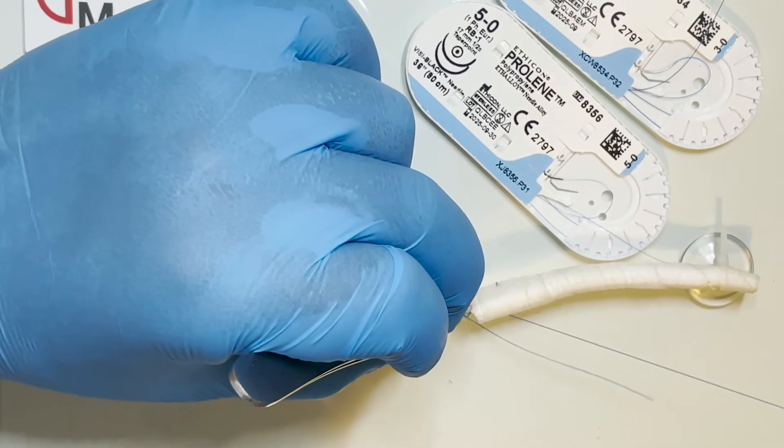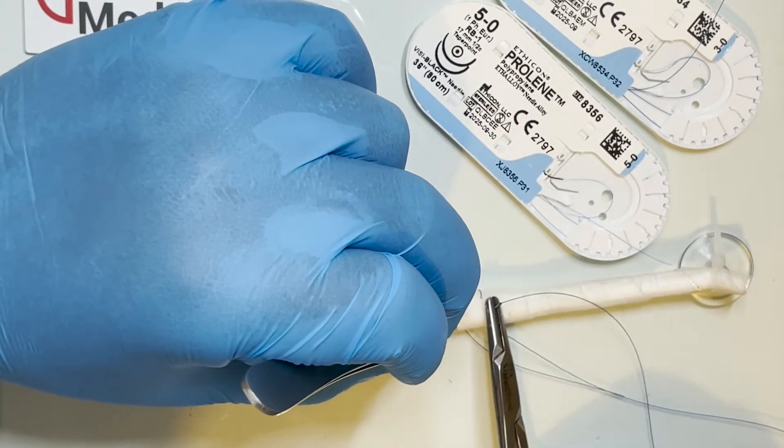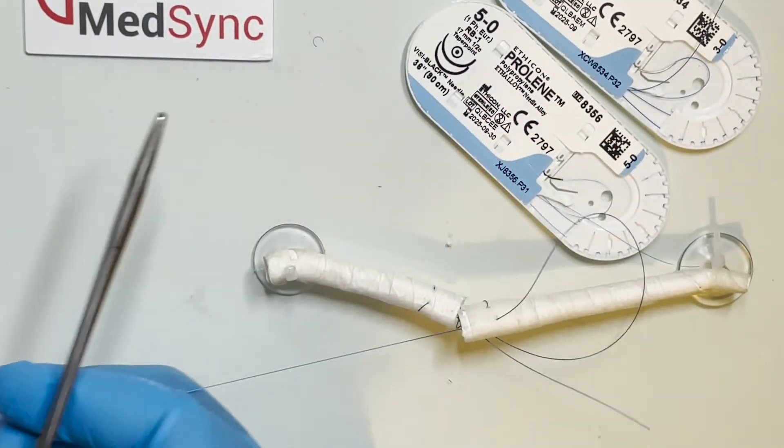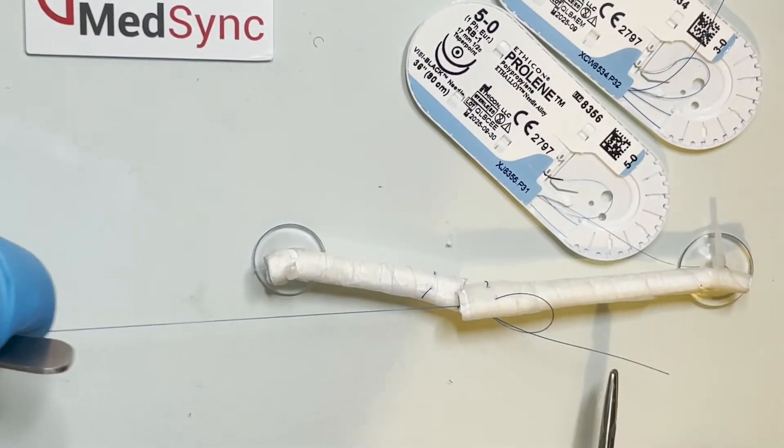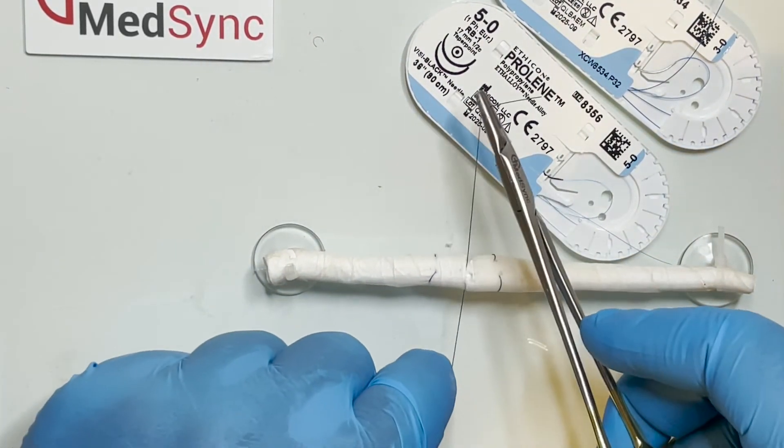A final pass is made axially back into the repair site and the suture ends tied. For a monofilament, four to six reef knots is recommended.